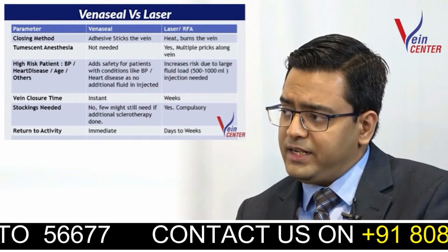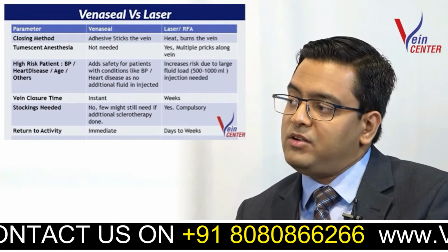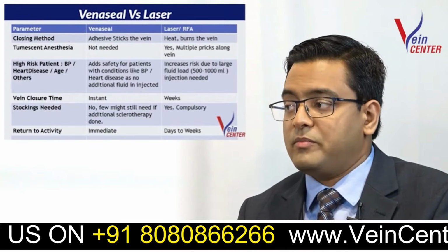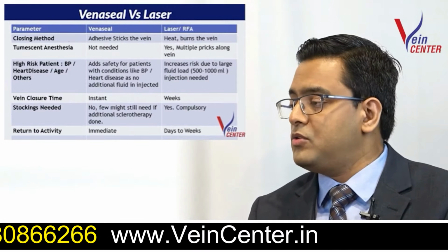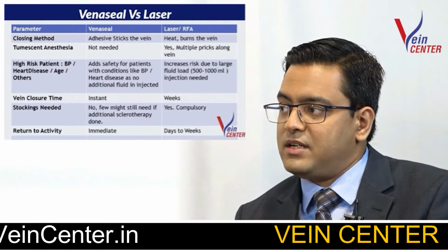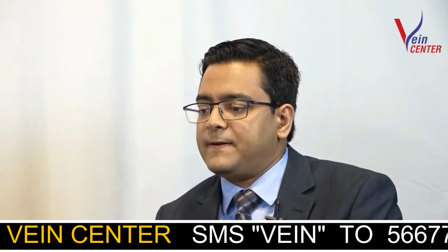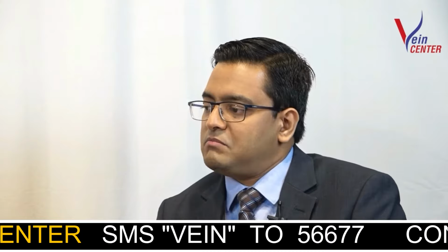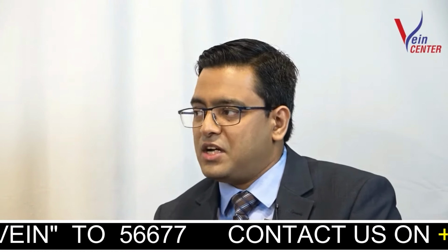Now, in India, there are also some special considerations. Both these devices are meant to be single-use devices. So medically, it's like an injection. You give an injection and throw it away. But due to cost constraints, laser gets rampantly reused, where it is re-sterilized and used again. This not only reduces the efficiency of laser, since each time you sterilize it, less energy is delivered, it has also increased the chance of infection.